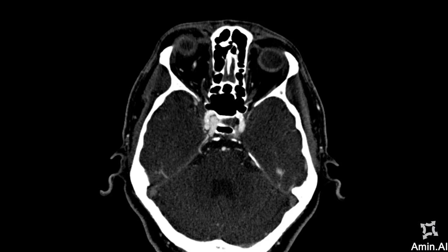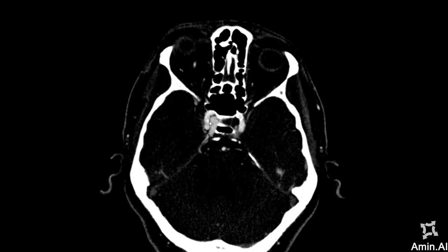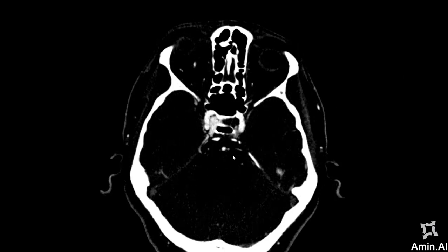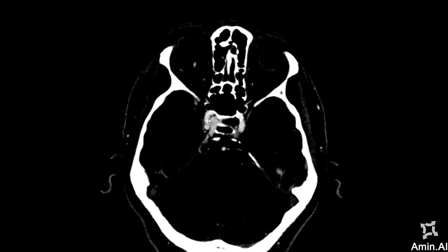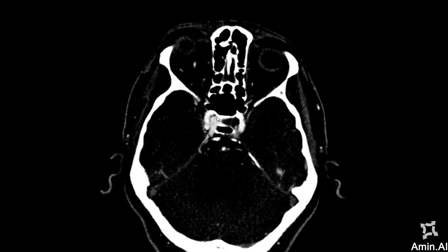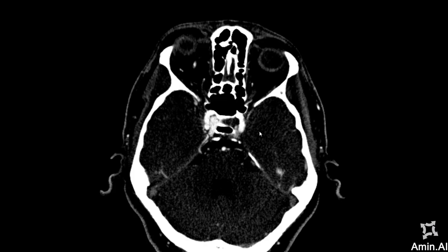If I window it for you, you will observe that this vessel is the internal carotid artery and this part is the right cavernous sinus. This is opacified and showing contrast pretty much early as compared to the contralateral side, which is the left side.